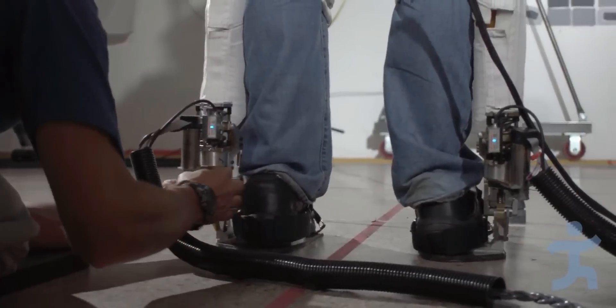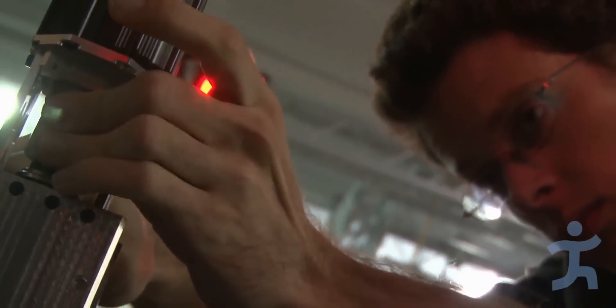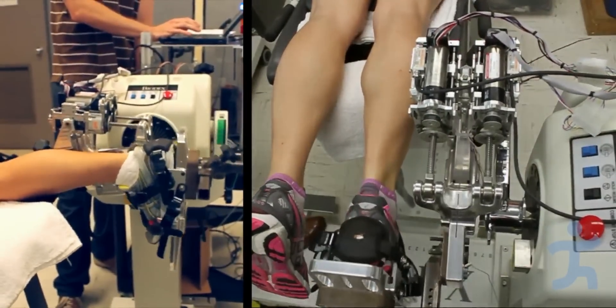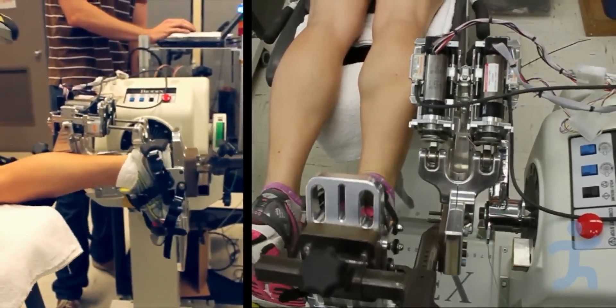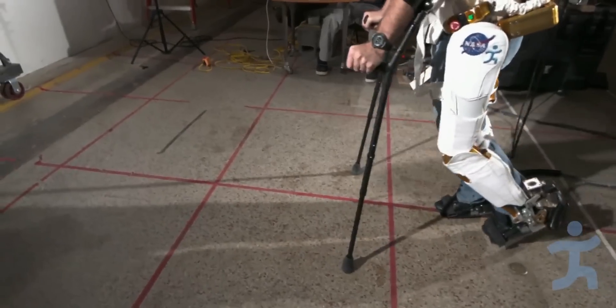Yesterday, we tested out adding powered ankles to our X-1 mobility assistance platform. The powered ankle has been in development for about a year and a half. We've done ankle exercise and ankle dynamometry with the ankle joint itself, and this is the first time we've added it to our X-1 platform.